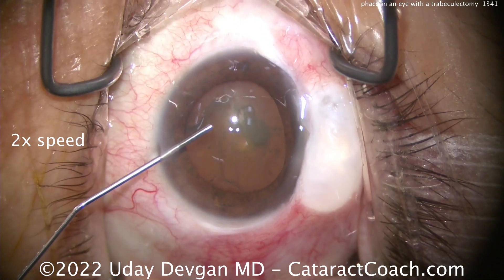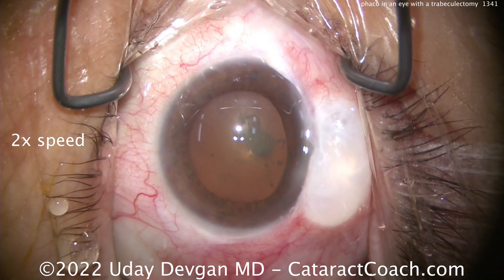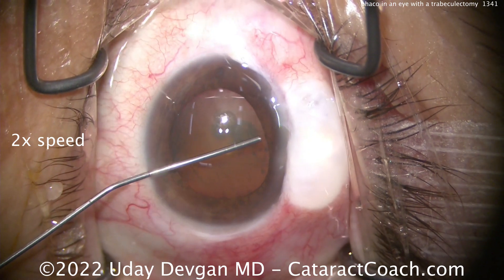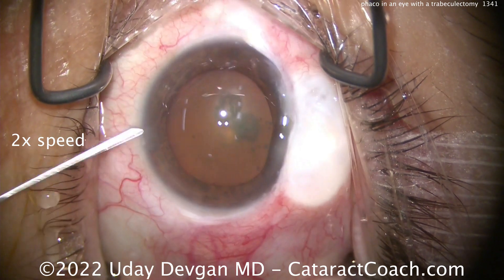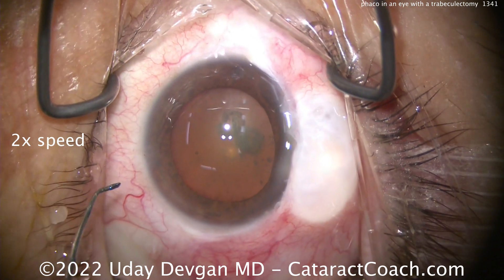This is a patient who has a functioning bleb — it works well and controls his pressure beautifully. The glaucoma specialist sent me the patient to do his cataract surgery. When I put in the viscoelastic, I'm going to put a little bit of a plug at the opening of the trabeculectomy, so I'm not going to overly fill the eye or get it super pressurized.